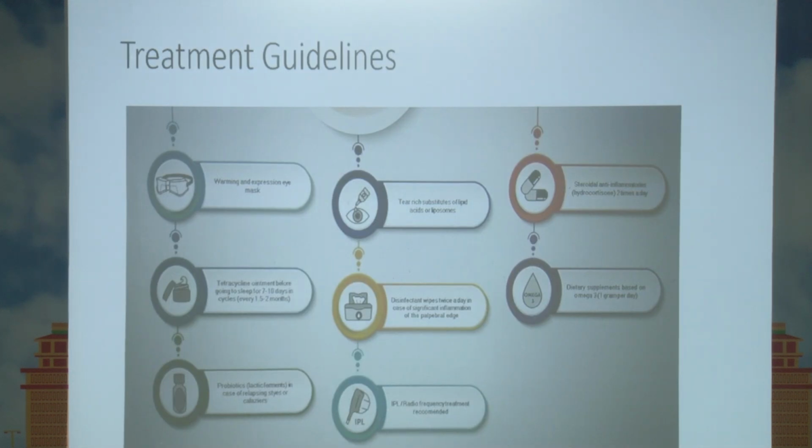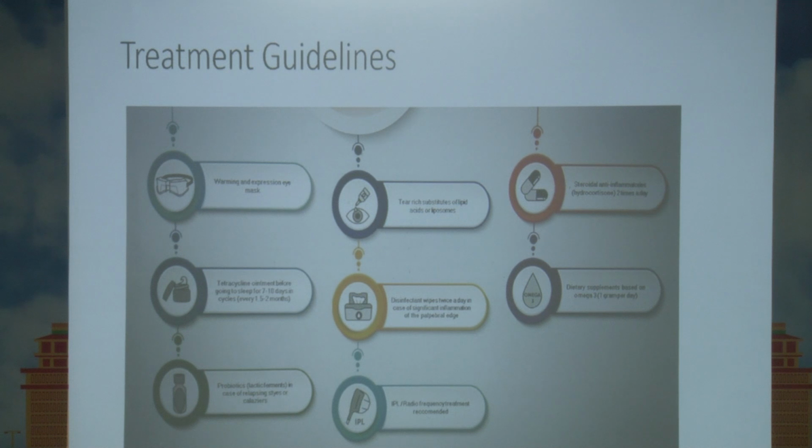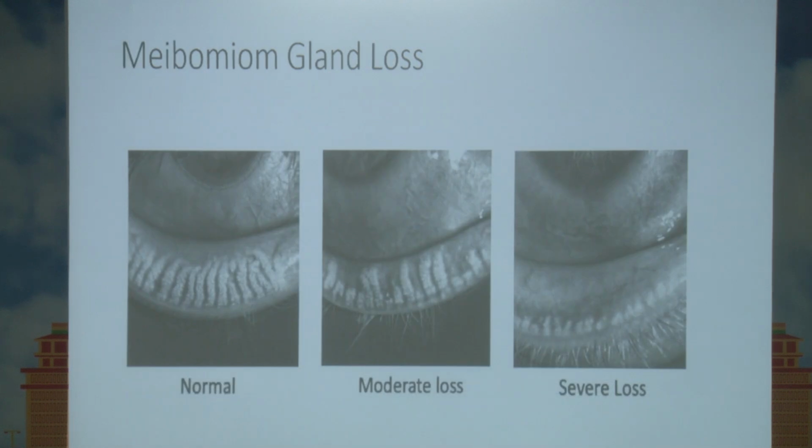And the machine also has a software that gives treatment guidelines, what needs to be done in which patient, whether it is warm compresses or antibiotic ointments or steroids or tear substitutes, and also the dietary supplement or even the radio frequency, whether the patient needs it or not.